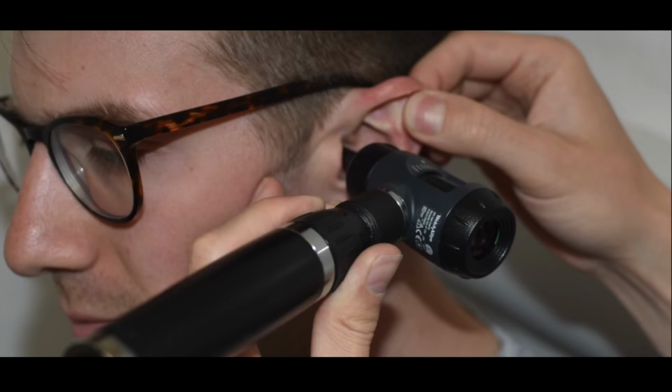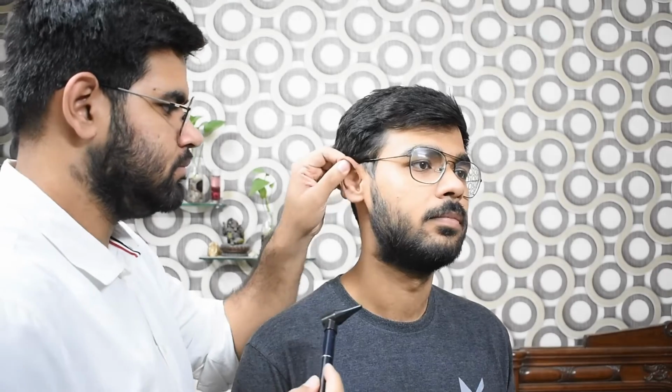Hold the otoscope like a pen, balancing between your index finger and your thumb. Extend your little finger and place it on the patient's face. This will ensure that you do not stab the patient's ear canal with the otoscope. To straighten the canal, move the ear upward, backward, and slightly away from the body.